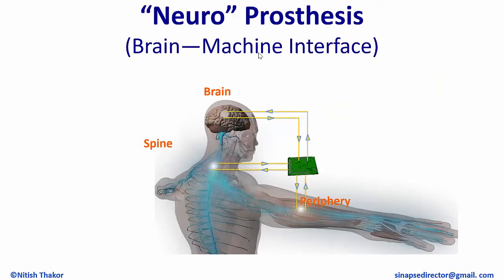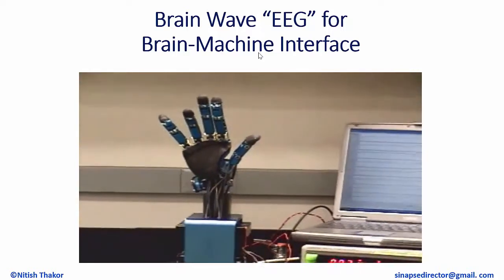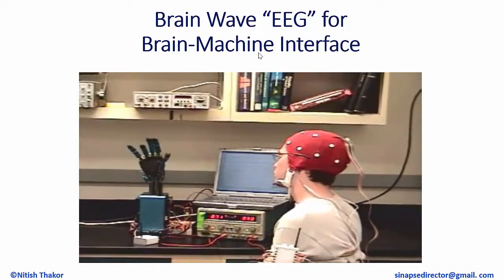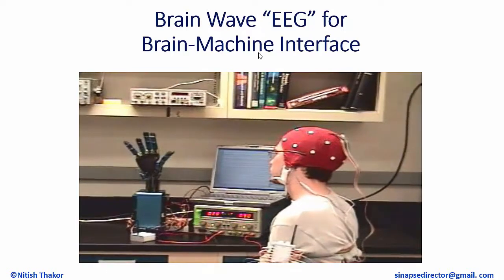Okay, let's go even a step forward. If I move my hand, it's actually my brain, my mind, that's controlling it. So that's the topic of what's called brain-machine interface, which means we can take signals from the brain. Of course, they carry over to the spine, to the nerves, to the arm. This is a very straightforward, simple illustration that you can decode even the brain waves, what are known as electroencephalogram, EEG. On the laptop, you can see some EEG waves. This student of ours is wearing a cap. Those white dots are the electrodes that record EEG signals. Then you can decode those signals to produce control signals for opening and closing the hand. So that's a very short introduction to brain-machine interface.